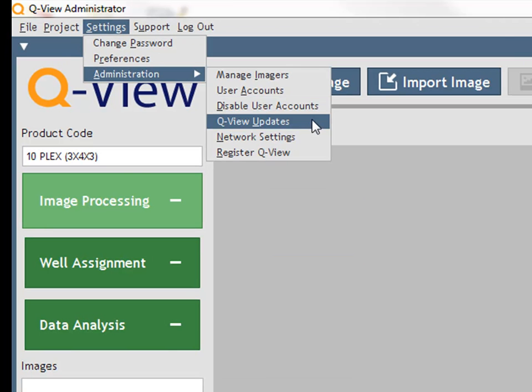QView updates allows you to set both software and product definition update preferences. Both the software and product updates can be updated automatically by selecting the option in Settings, Administration, QView updates.